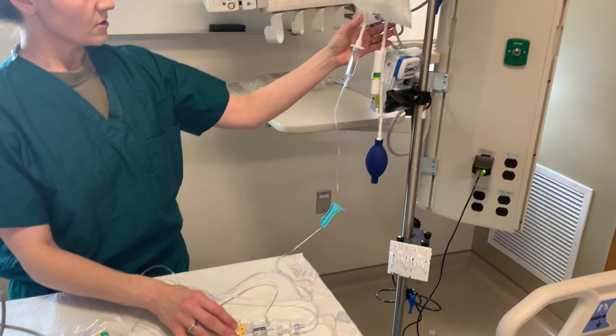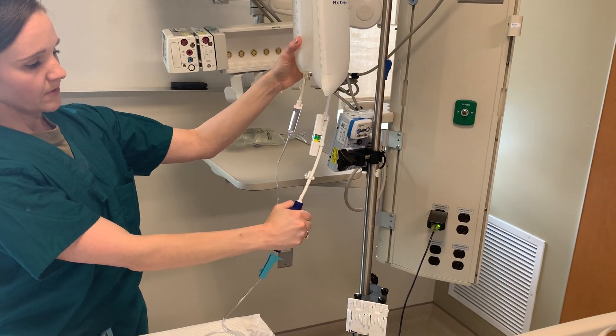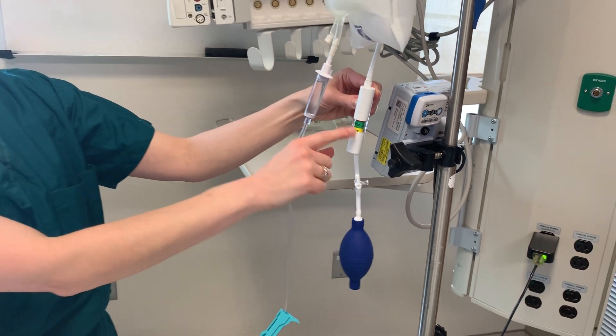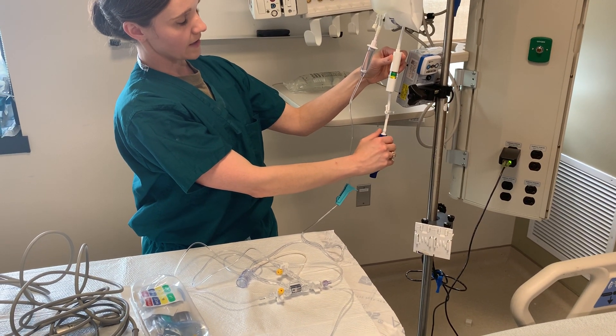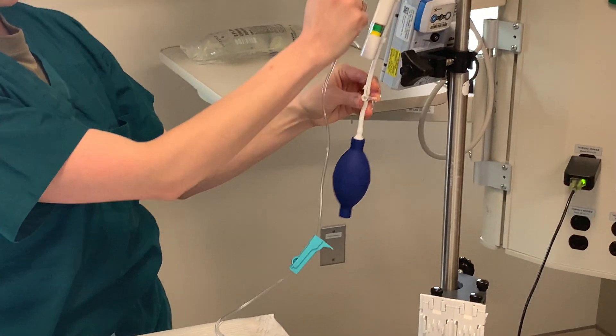After you spike your fluid bag, you can increase the pressure by pumping the bulb up until you reach approximately 300 millimeters of mercury of pressure — the green color is a good indicator. After you're done pressurizing the bag, you will turn this stopcock off to the bag, or in the up position.